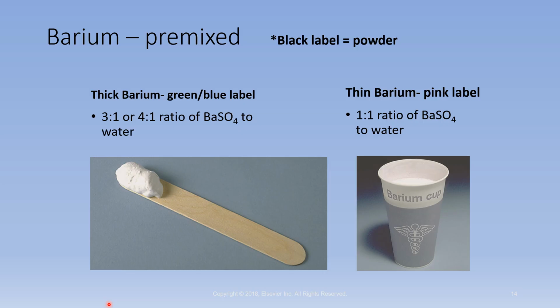And the speech therapist would give these to the patient one by one. They would label on there the different consistency that they're giving them, and the entire exam is videoed, and the imaging is videoed, and we are simply there to set up the tray for the speech therapist.